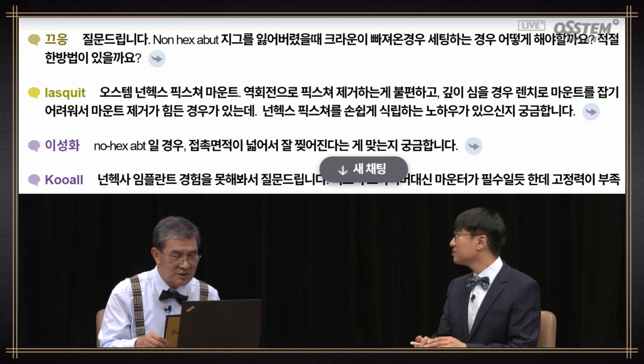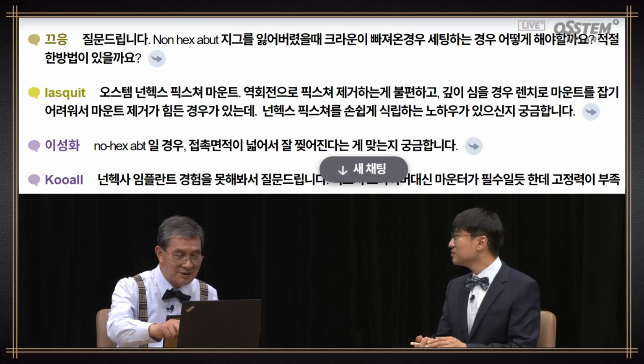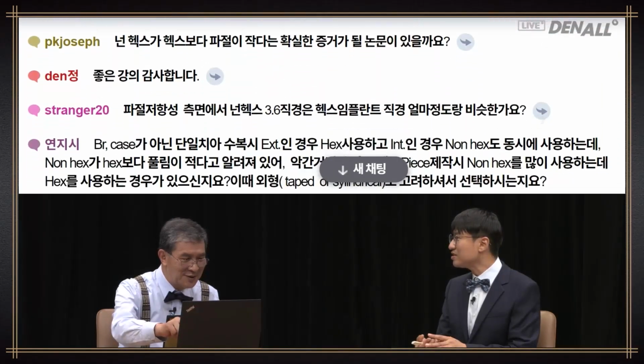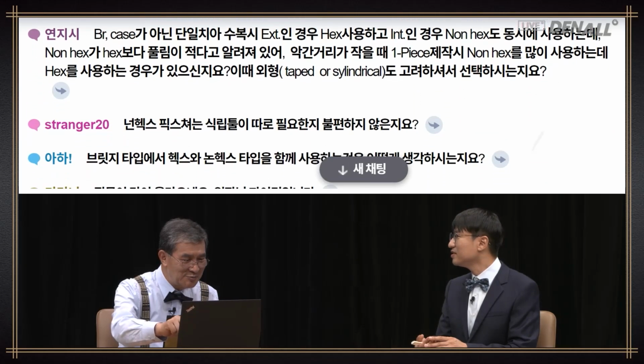What if I lose the non-hex abutment jig and the crown has fallen off? How can I set it? Is there an appropriate way? You need to have the lab remake the jig after taking an implant level impression.